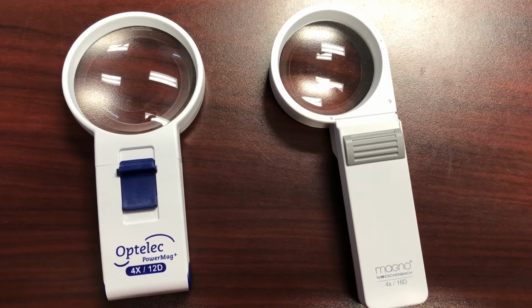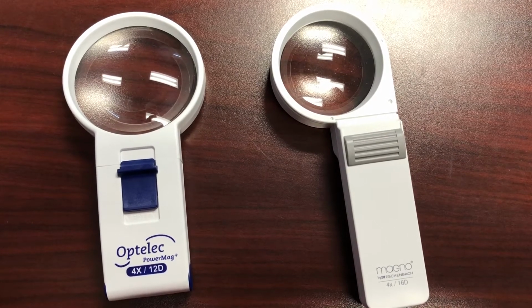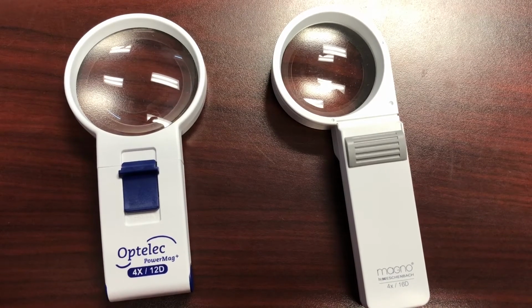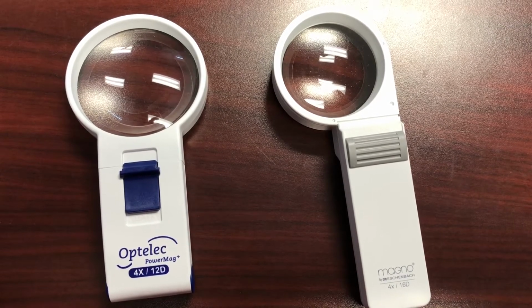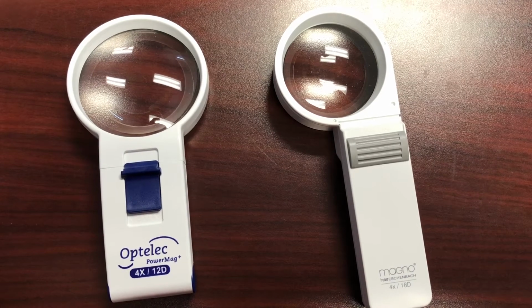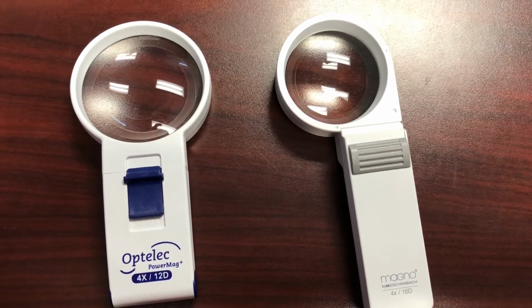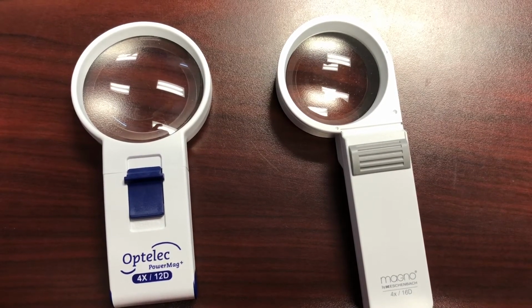You'll note that the lens on the right is slightly smaller than the lens on the left. Both report to be 4 times magnification, but really truly the magnification between the two is not identical because you have 12 diopters on the left and 16 diopters on the right. So these will be general comparisons today, not perfect comparisons. First, we're going to compare the brightness when looking through the stand magnifiers.